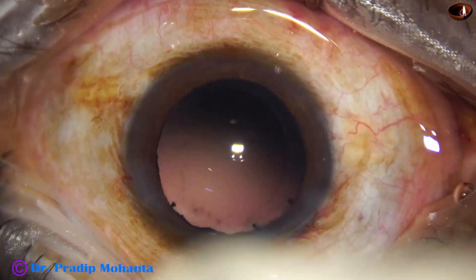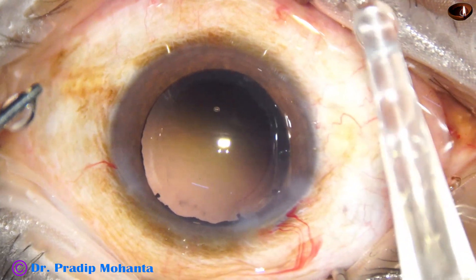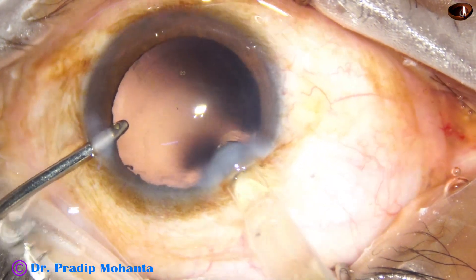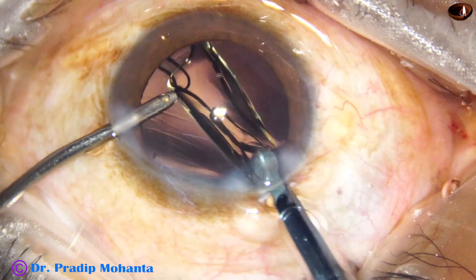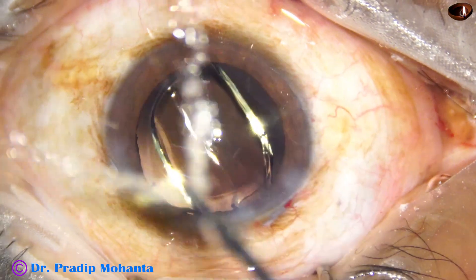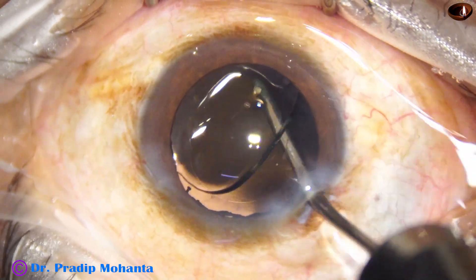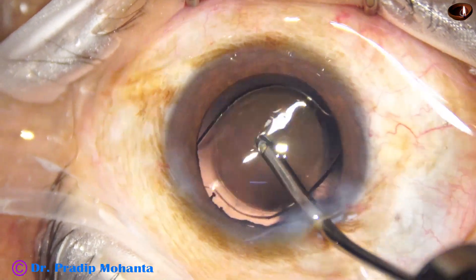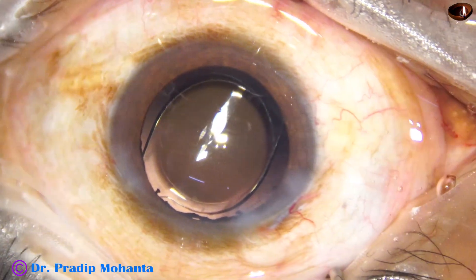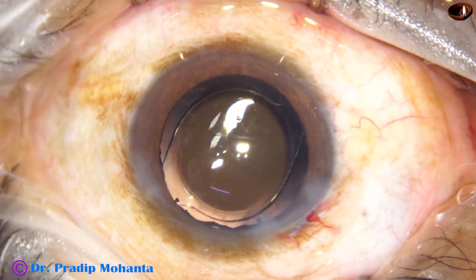In this case we have selected a hydrophobic acrylic single-piece monofocal aspheric intraocular lens from Appasamy Associates, known as the Galaxy Fold or Super Four intraocular lens. It is a beautiful lens — no financial interest — but many thousands of ophthalmologists in India are grateful to Appasamy Associates for bringing equipment at affordable prices. The lens is now in the bag.